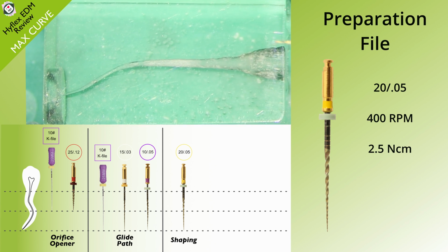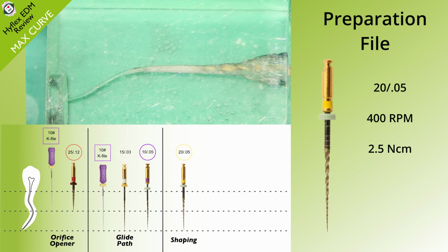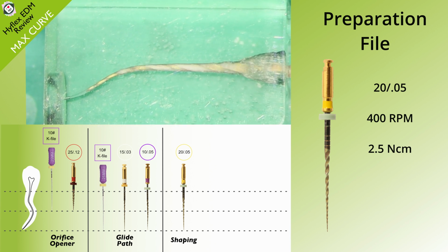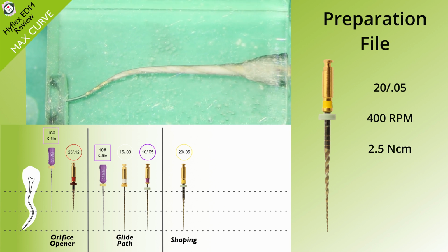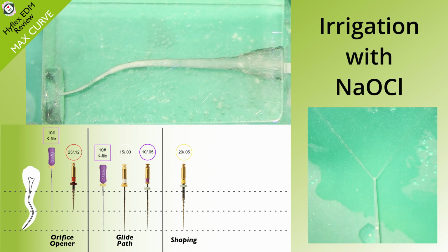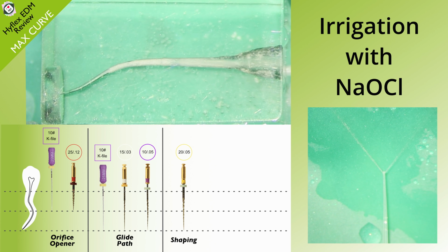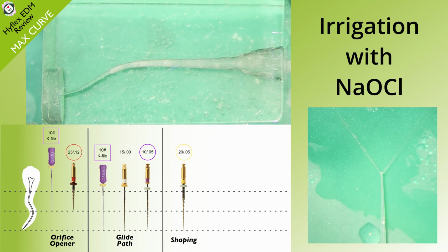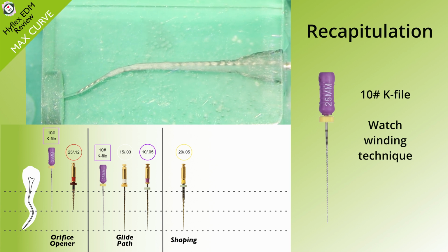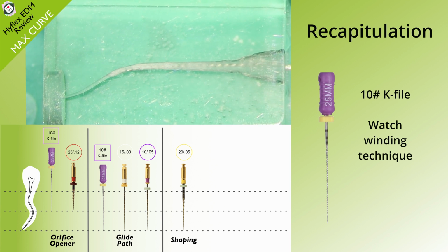And again, using the preparation file, the size 20.05. And because this canal is, you know, an S shape, it's really difficult. We're going to be actually finishing on this size 20. And here again, just shows the Hyflex tips, how great they are at removing the debris. And more recapitulation here.